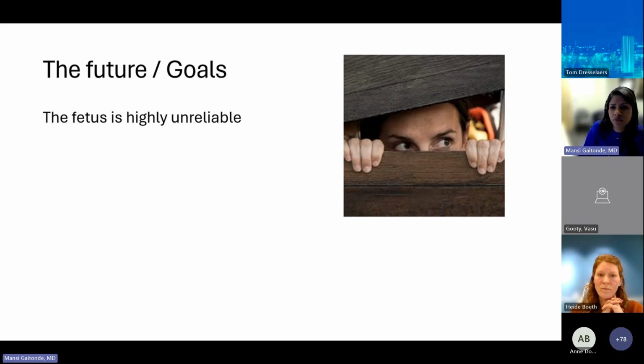So from our standpoint, we're hoping to transition towards more deep learning methods for reconstruction of these data sets. That does take a lot of investment, and you have to kind of take a plunge if you've never done this before.